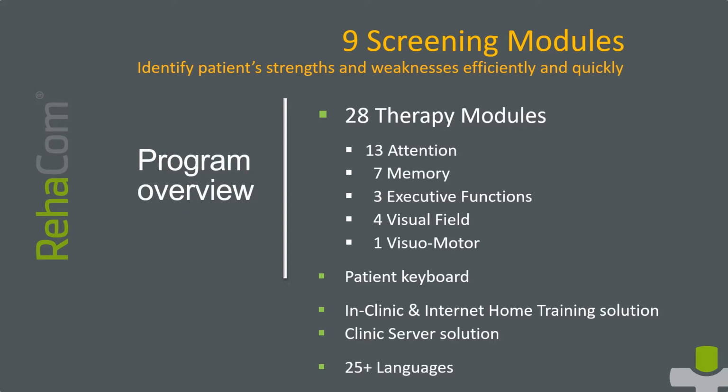But what about the essential importance to treat the patient in his mother tongue? Don't worry, we have made sure of that too. Our software always has more than 25 languages implemented.